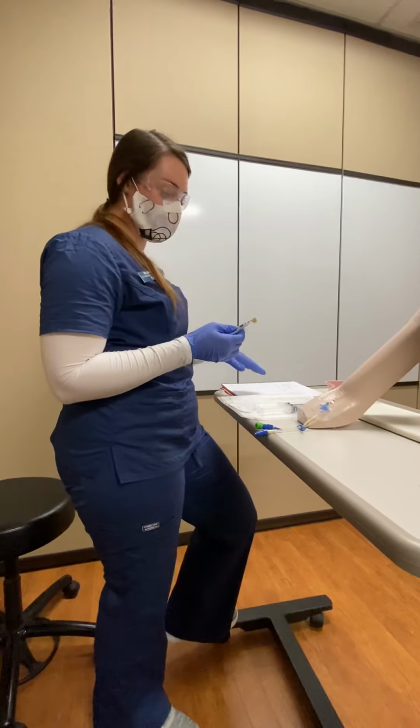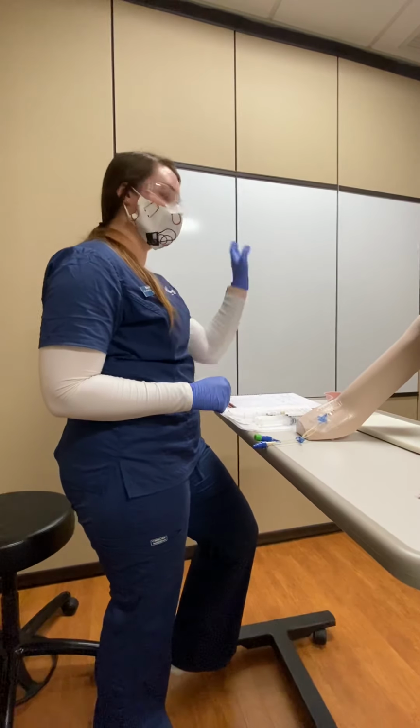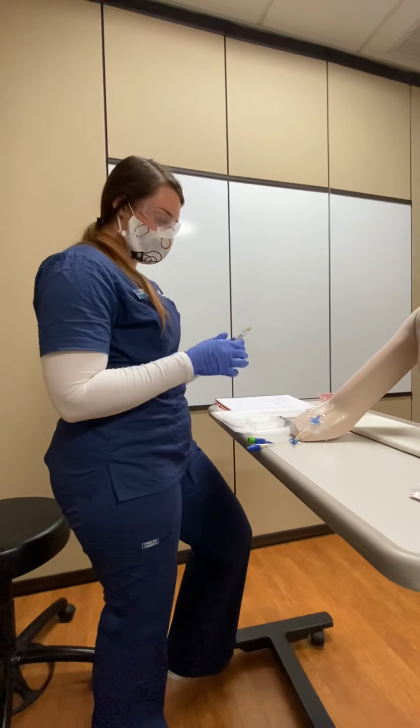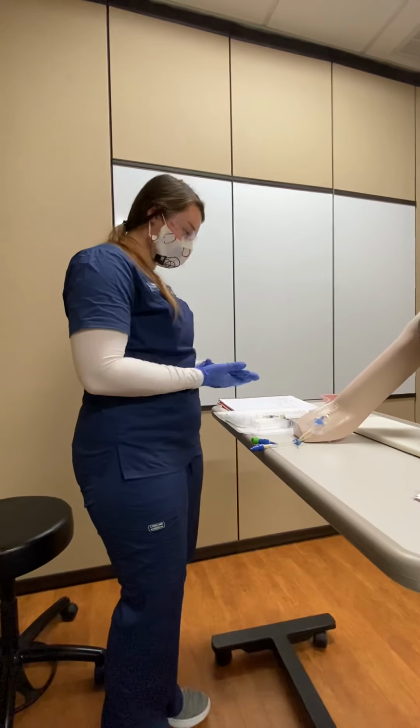It does not need to be diluted per the drug book, and there is nothing hanging or running through the lines, and it is compatible with normal saline, so we're good there.